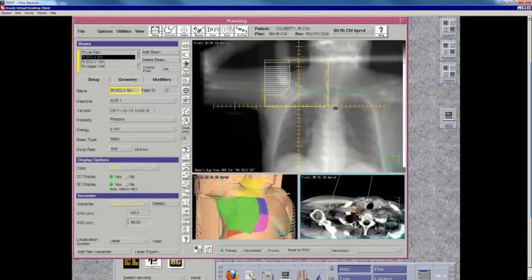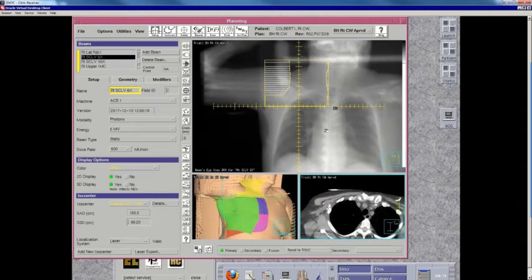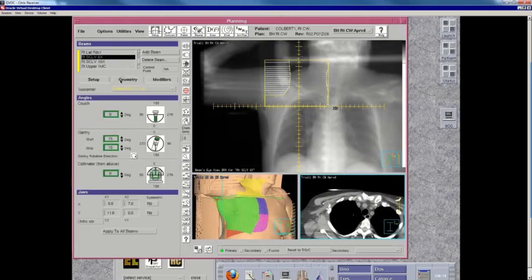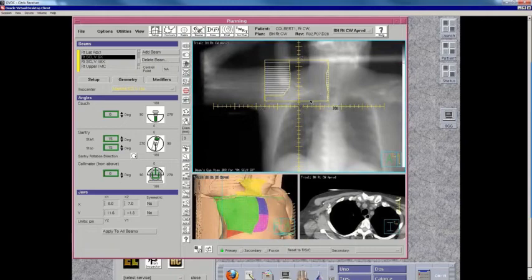for your medial border. Now, the inferior border of the match line is something very important and something that people screw up. For example, I've reviewed way too many treatment plans over the years where people put their inferior border right there. I can't turn the contour on right now because we are having a confidentiality issue on the contours page, but the problem is this patient had her malignant node right there. If you put your border that high, unless you do something wonky with your tangents, you're totally going to miss that space.